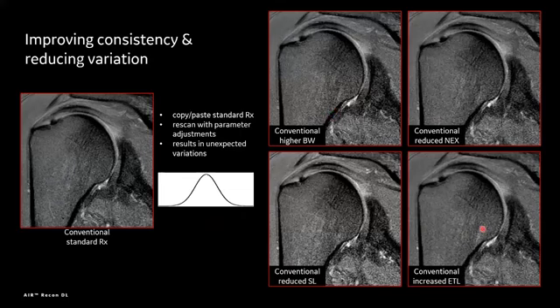They did something bad to the image. Some were worse, some not so bad, but the overall variation was considerable. From this conventional image on the left-hand side, I got quite a range of results, some I expected, some I didn't. All of this is with conventional reconstruction.